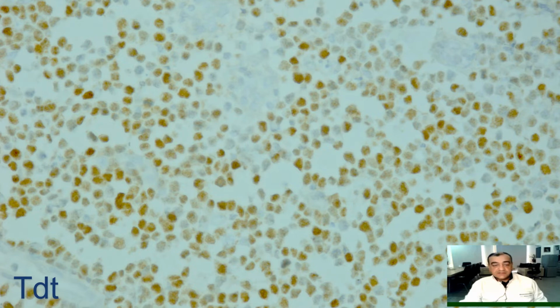Here is shown the nice positive nuclear staining of the terminal deoxynucleotidyl transferase, TDT, which shows the blastic origin of the tumor cells. So after all those steps, we can easily recognize that we deal with a mediastinal mass with involvement by T-cell acute lymphoblastic lymphoma leukemia.